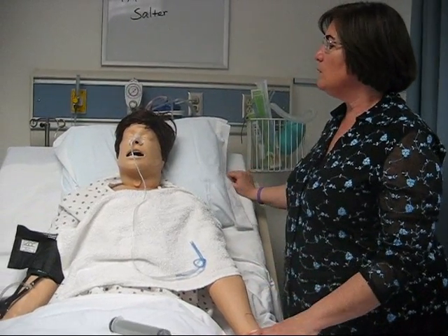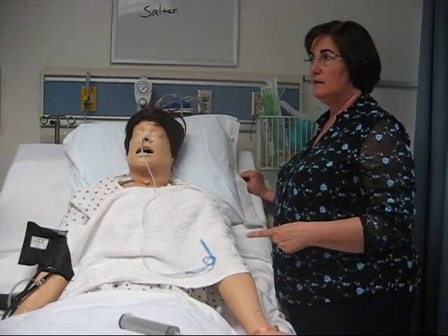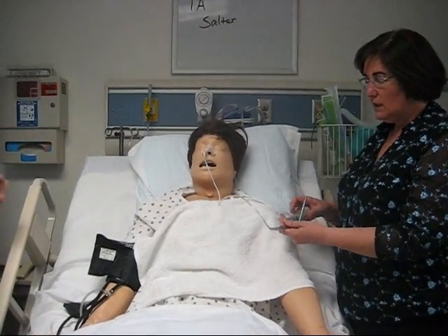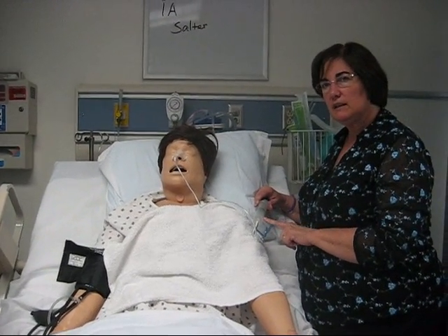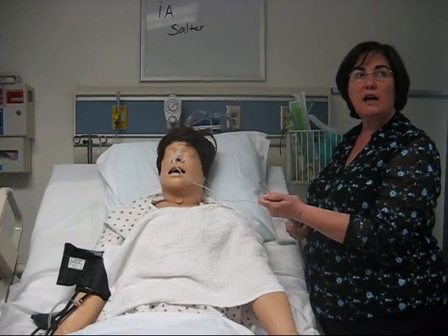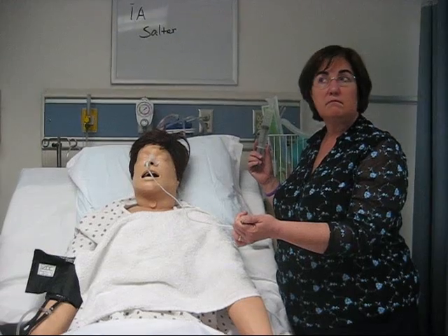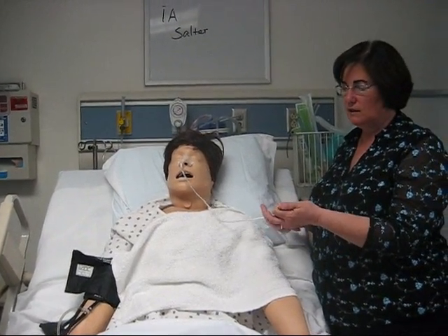So how did we say we were going to verify that the tube is still in his stomach? That you see the stomach contents? Gastric residue. Okay. Residual. So one thing I could do is aspirate and look at it to see if it's stomach contents. We talked about that being a little less specific, but we're going to see people doing that. I could then take that, and if you work at a hospital where they do a litmus paper check, I could put the gastric contents on the litmus paper. Oh, the pH. The pH would be very low because stomach contents should be acidic, and so on.